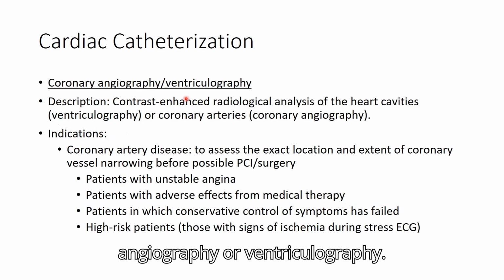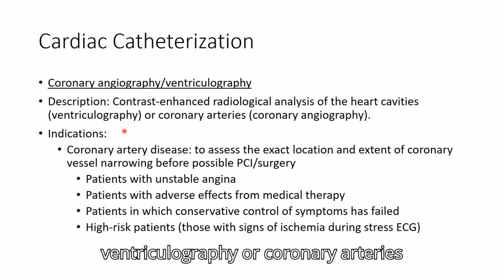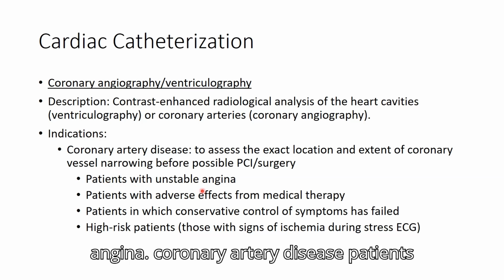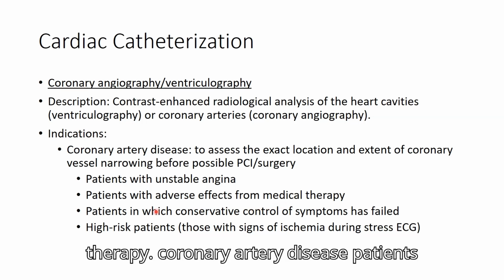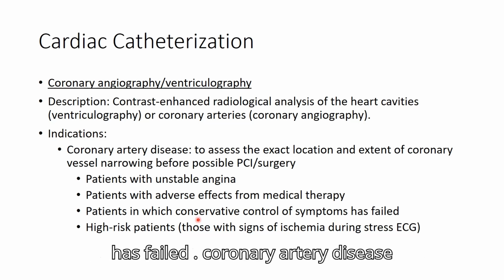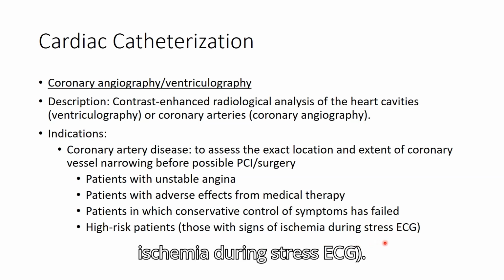Coronary angiography or ventriculography. Description: contrast-enhanced radiological analysis of the heart cavities, that is ventricles (ventriculography), or coronary arteries (coronary angiography). Indications: coronary artery disease patients with unstable angina, coronary artery disease patients with adverse effects from medical therapy, coronary artery disease patients in which conservative control of symptoms has failed, coronary artery disease high-risk patients, those with signs of ischemia during stress ECG.